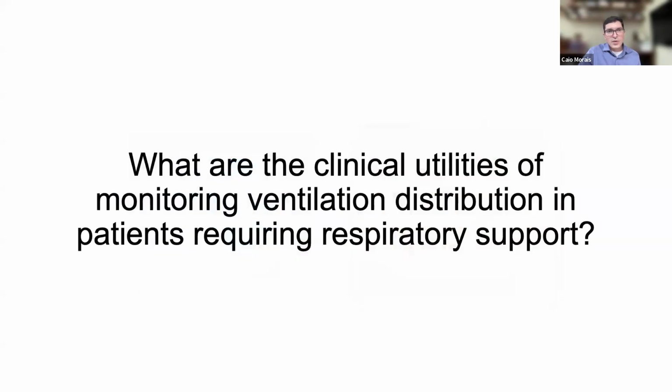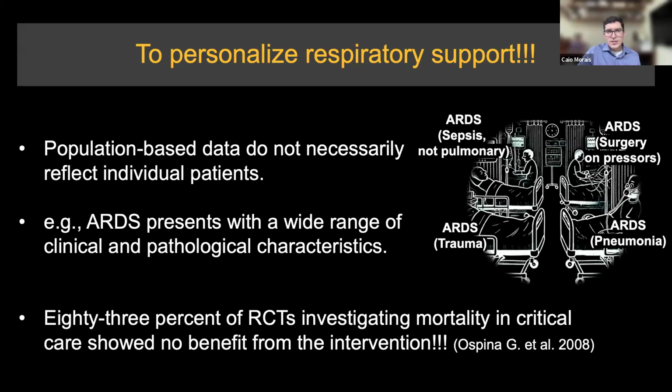And what are the clinical utilities of using this simple method, the ventilation image, to support the respiratory treatment? Why are we looking for that? Why do we need this kind of information? So the answer is easy. It's because we need to personalize the respiratory support. We know that the population-based data do not necessarily reflect individual patients.